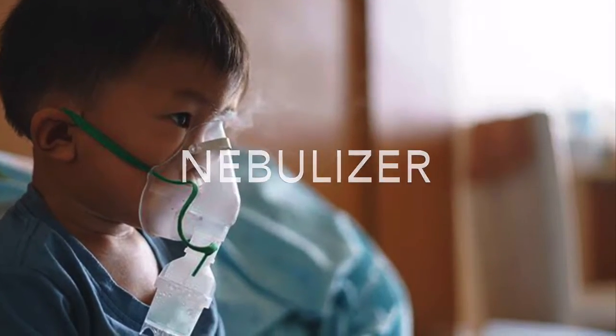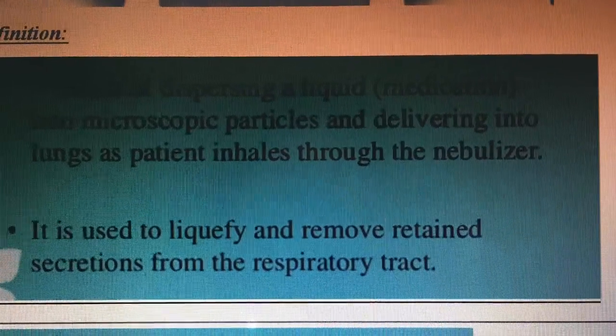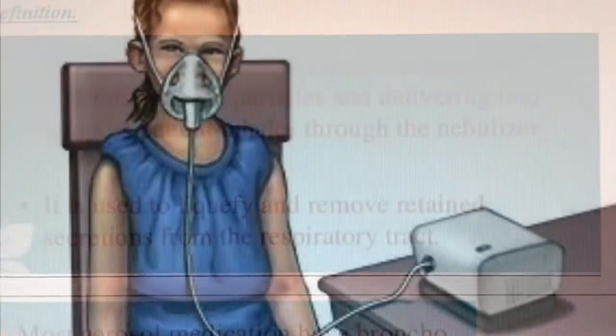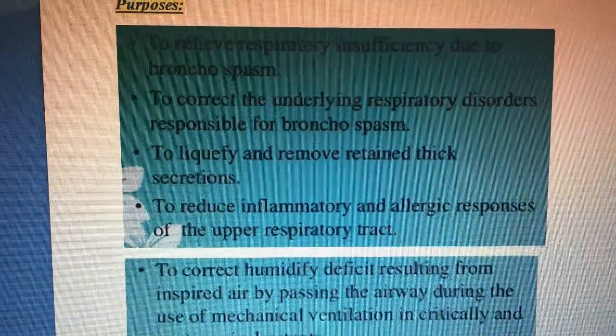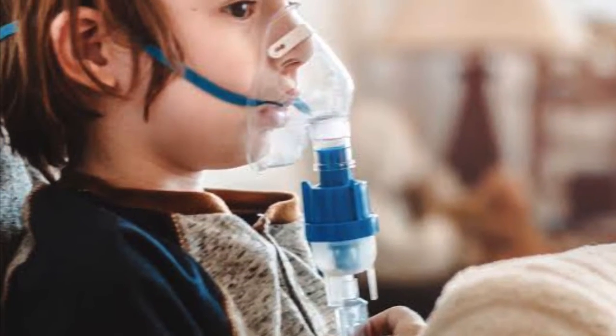A nebulizer is an electric machine powered by an outlet and plug or batteries. It turns liquid medication into a fine mist that is inhaled into the patient's lungs by a mouthpiece or a face mask. This delivers the medicated mist and helps the patient breathe better.